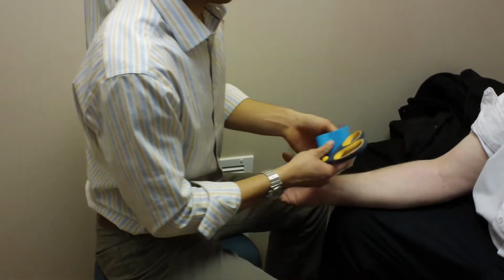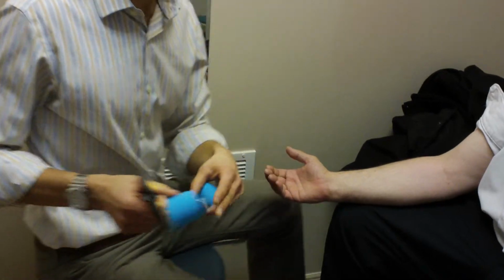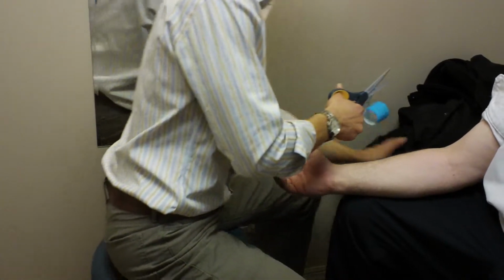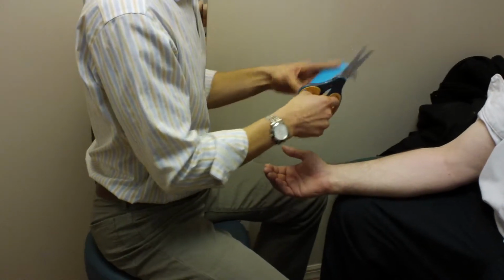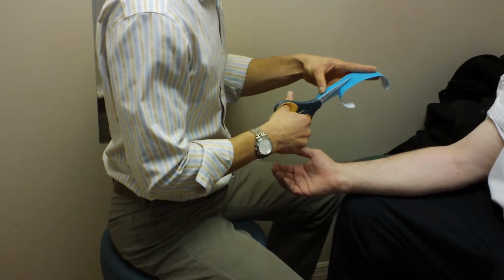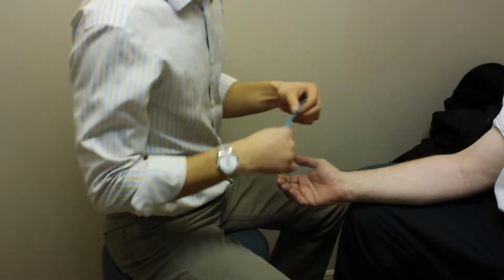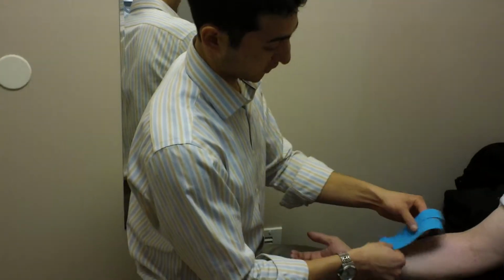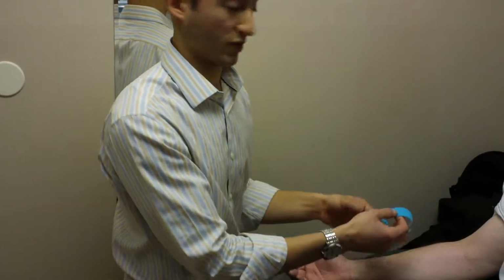So from about right here. We're going to even off our edges. And we're going to use our Y-shaped pattern, which is the best for this type of technique. Now again, since we have a muscle here that's over-contracted, what we want to do is allow the Kinesio Tape to actually keep the muscle from contracting. So to do that, we're going to start at our insertion, and we're going to work up towards the origin. And that'll help to keep the muscle from contracting.